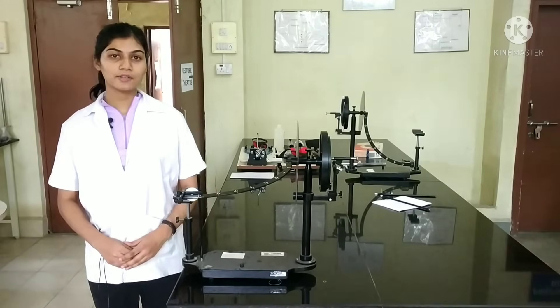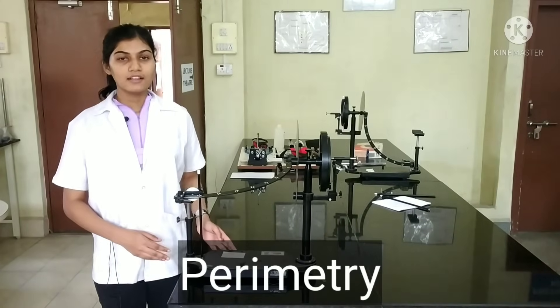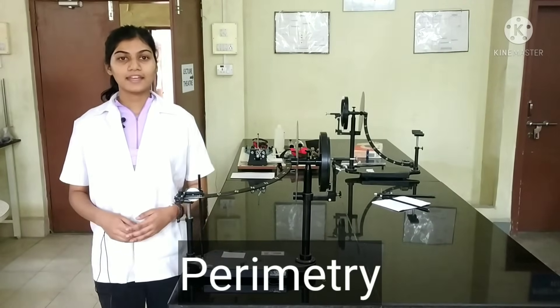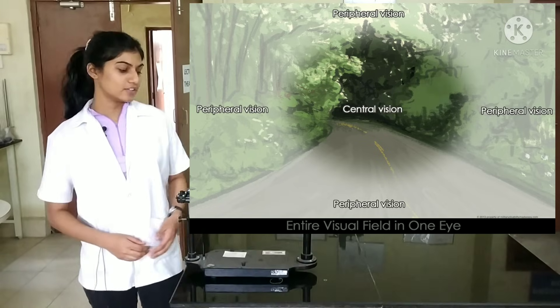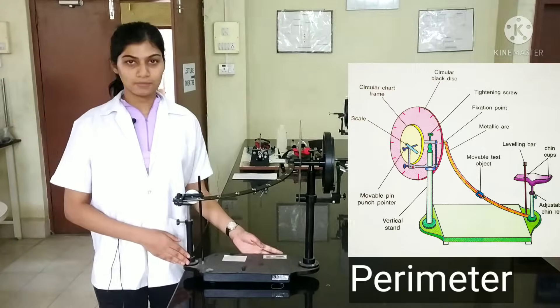My name is Priyanka Kulkarni and today we will be learning about perimetry, that is the method to determine the peripheral field of vision. The instrument that we use is called a perimeter.